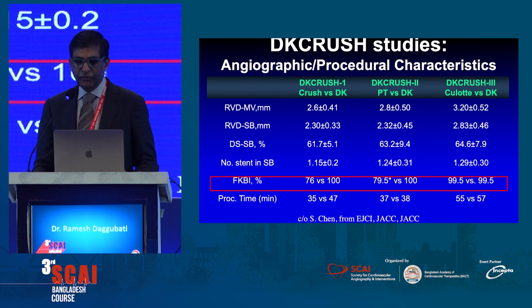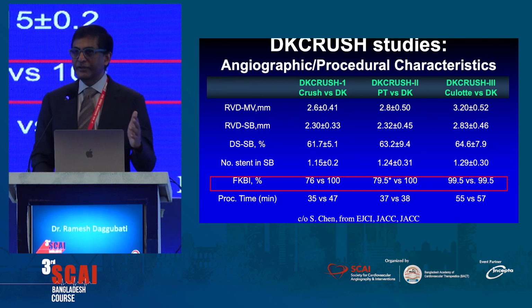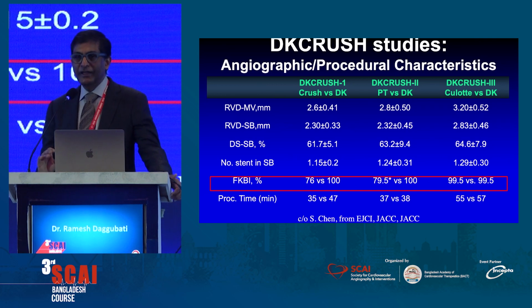If you look at the incidence of final kissing balloon that was used in these 2 studies, in crush only 76% of the time was it used, whereas it was 100% in DK crush. One of the important things is that if you want to perform the DK crush technique, you need to understand that there are a couple of steps. As Dr. Mir Jamaluddin told us yesterday, you need to do a stepwise kiss. So there are a couple more steps, but that gives you the best result. So you have to take that much time.